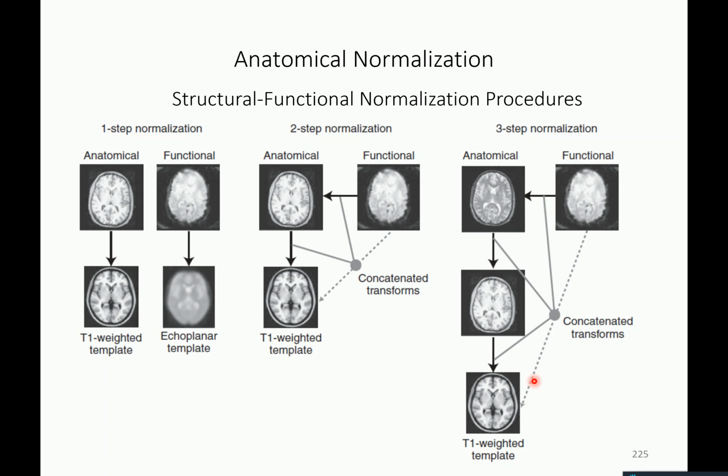So the thing is, there are these ways, and you can get completely lost in using the parameters from this here and there, and of course that makes the whole programming more complex. Sometimes I feel people just do it because it can be done, not because there are good reasons to do that. But the basic idea is that you morph an individual's brain into a standard space.